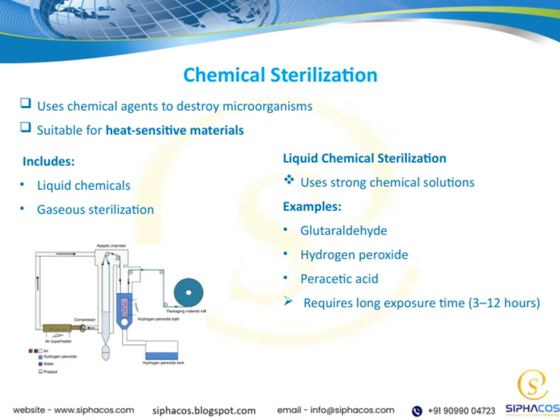Some common examples include glutaraldehyde, hydrogen peroxide, and peracetic acid. These chemicals are powerful, but one important thing to keep in mind is that they require a relatively long exposure time, anywhere from 3 to 12 hours, to ensure proper sterilization.